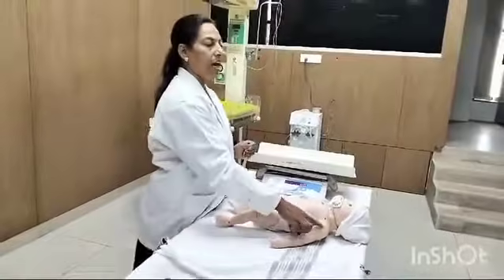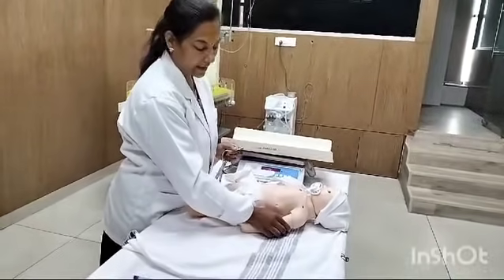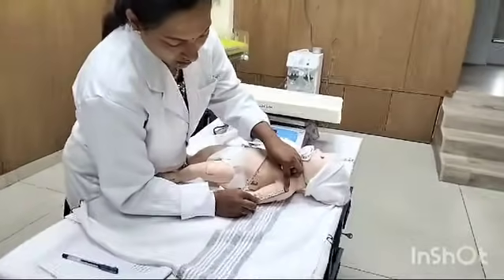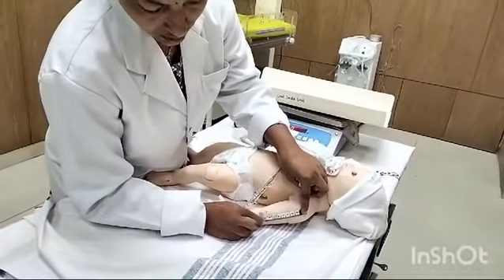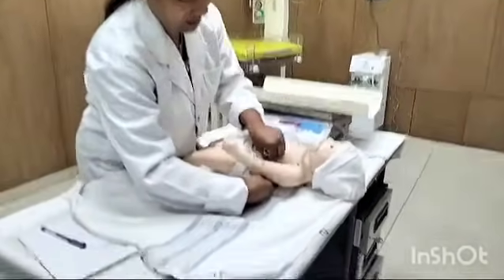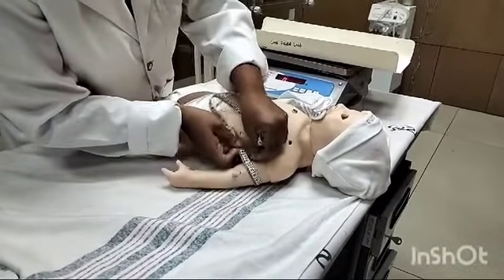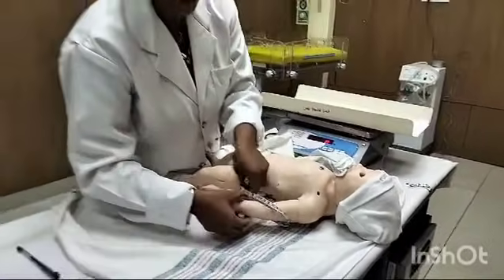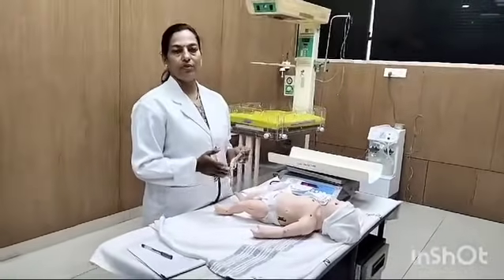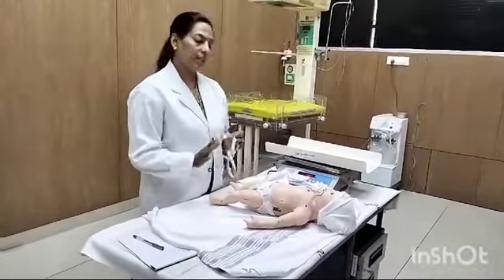Now we need to measure the mid-arm circumference of the baby. If you know the midpoint of the arm exactly, you can take it directly. But if you don't know, measure the total length from the acromion to the elbow, take the midpoint, and measure there. If the mid-arm circumference is less than 12.5 centimeters, it indicates the child has protein energy malnutrition. If it is 12.5 and above, then it is normal.